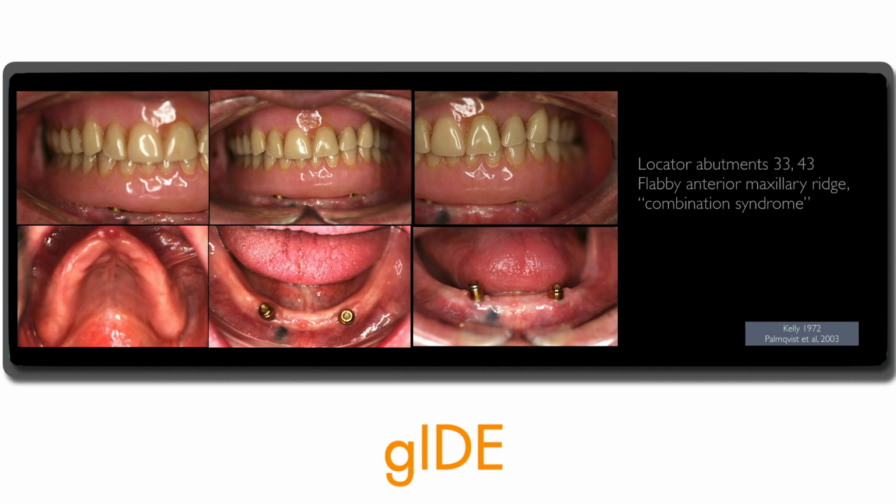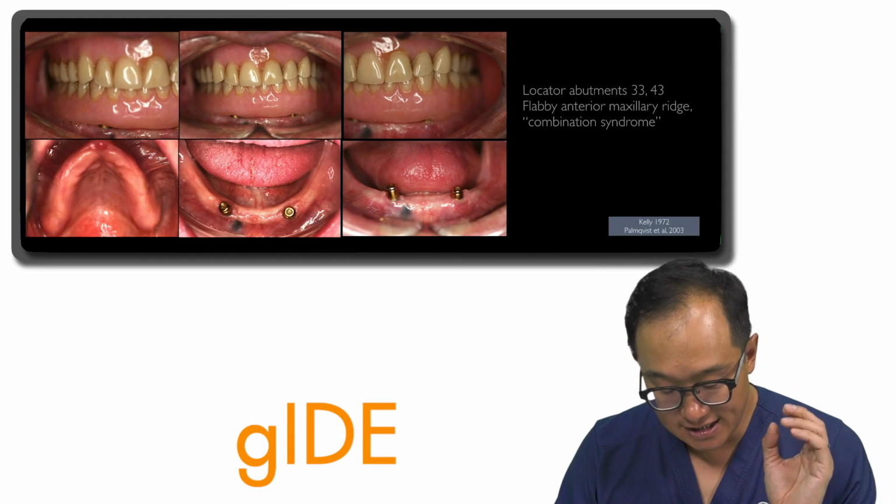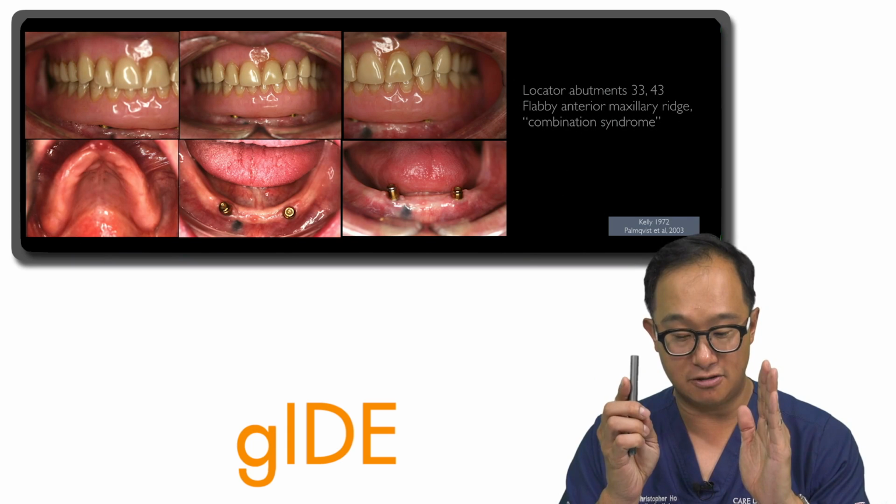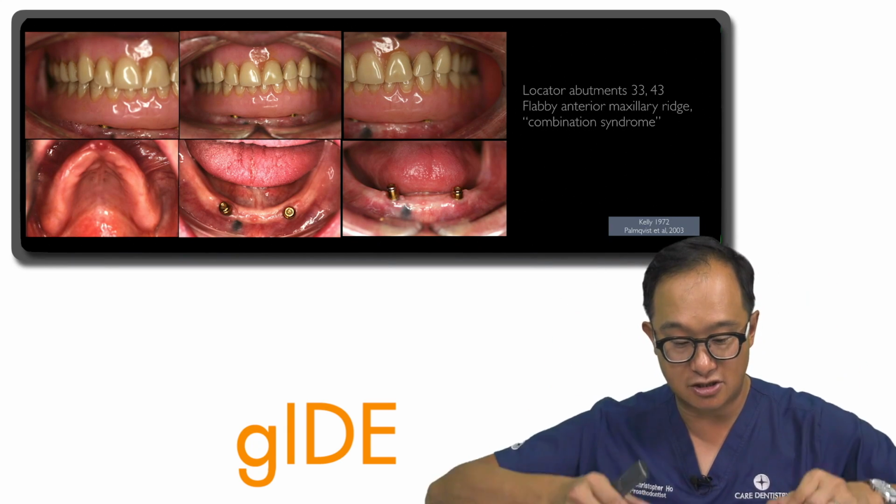If you look intraorally, you'll see the different attachments, and you can probably see one of the other reasons why this case had more problems was that not only did they have a flabby maxillary ridge, but in the mandible you can see the 2 implants, they're slightly divergent. Ideally, the positioning of the implants should be aligned so they're completely parallel so that the attachments can engage correctly.